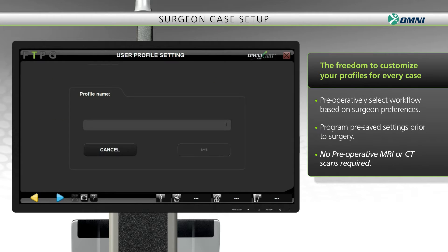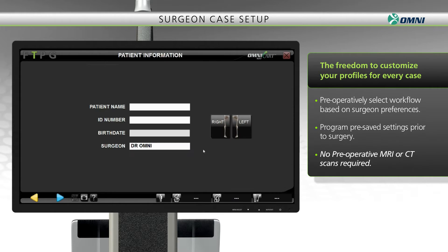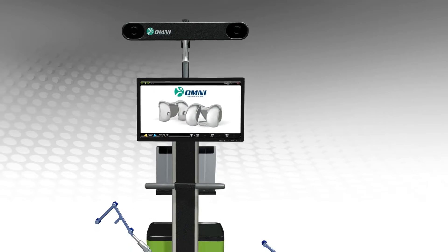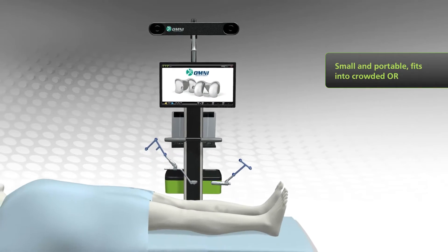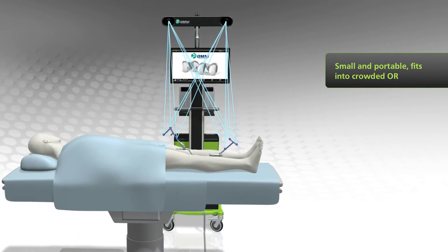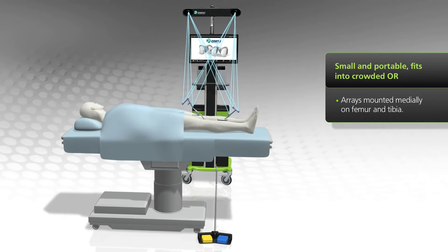Now, let's head to the OR. Small and portable, the Omni robotic workstation can be easily positioned in a crowded OR, with its overhead camera typically located within 5 to 8 feet of the operative knee.